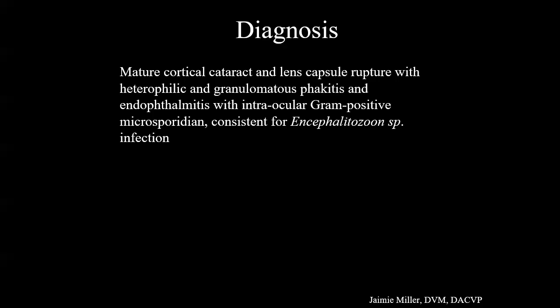Any questions, comments for this case? Comment a little bit on how does that happen? The vertical transmission through the fetal vasculature, kind of in utero during development. Yeah. How old is it again? 1 year. So perfectly said. Yeah. Cool.